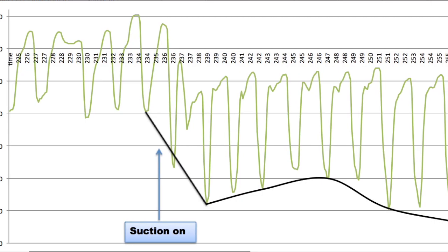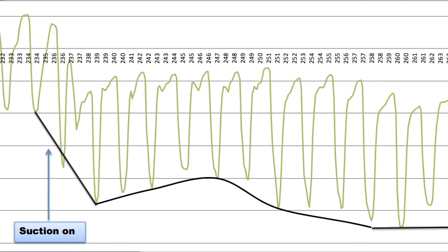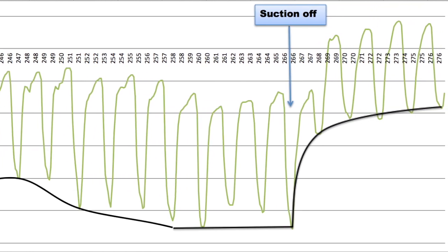In contrast, in non-expandable cases, the pressure drops rapidly and reaches a plateau during application of suction, followed by a rapid increase during recovery.